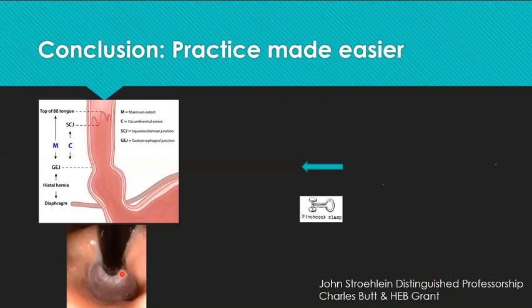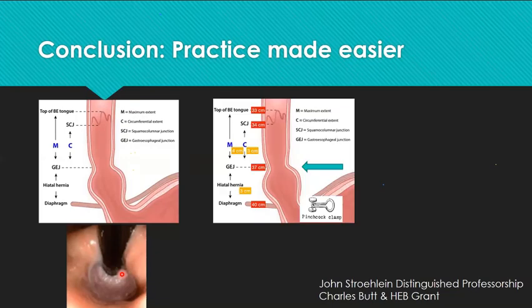And my nurse says, oh, now you are at 40 centimeters. Thank you. What centimeter now? Because I checked that there's only a hiatal hernia. My nurse says, oh, this is 37 centimeters. And I just found the circumferential Barrett's area. What's the centimeter? It's 34, and the top is 33, and then I write it down like this.